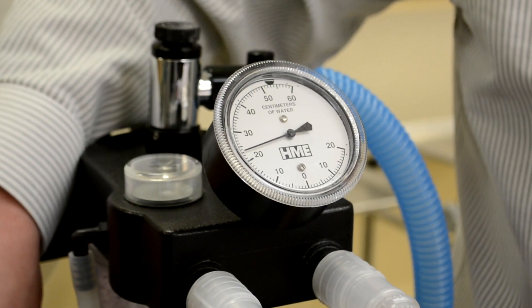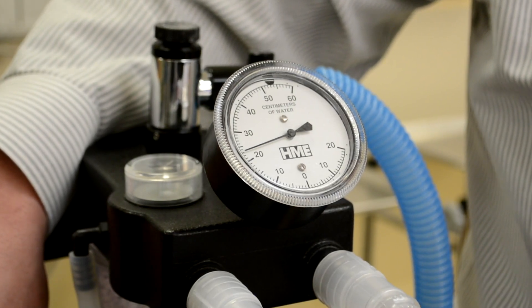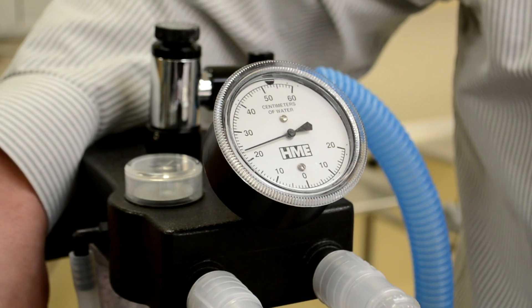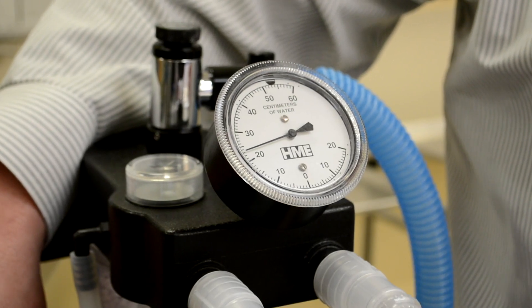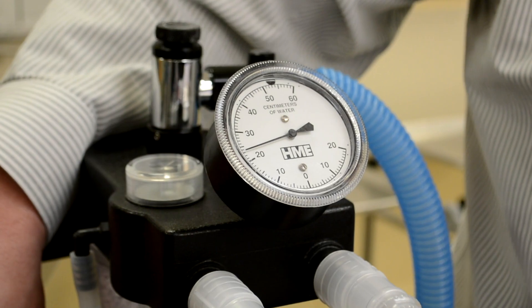I'm going to turn the oxygen flow off, and then for about 30 seconds you're going to watch to make sure that the pressure in the system doesn't change. If the pressure is going slowly up, it means you still have oxygen coming into the system. Or if the pressure is coming down slowly, it means that there's oxygen leaking out of the system. So this is held nice and steady here at about 22 centimeters of water.